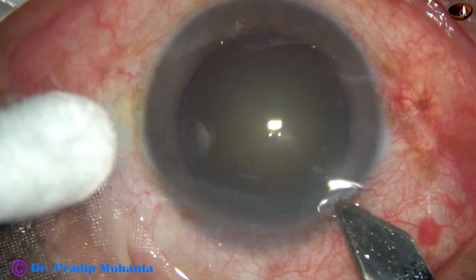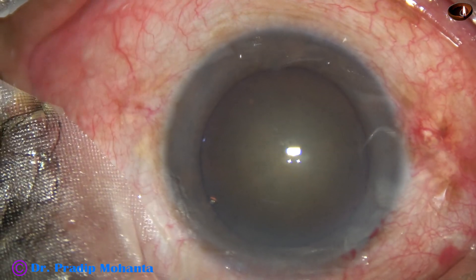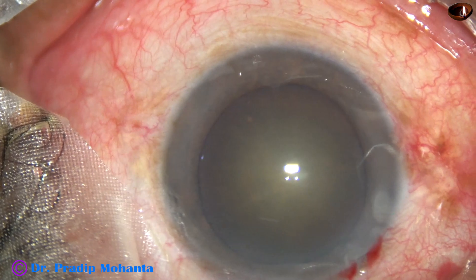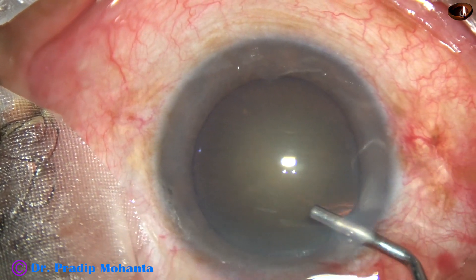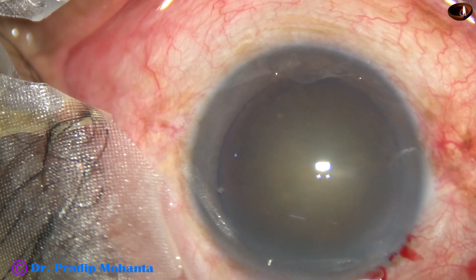This is the main incision with a 2.8 mm steel keratome on the posterior aspect of the limbus. Now, 2% hydroxypropyl methyl cellulose is injected into the anterior chamber.